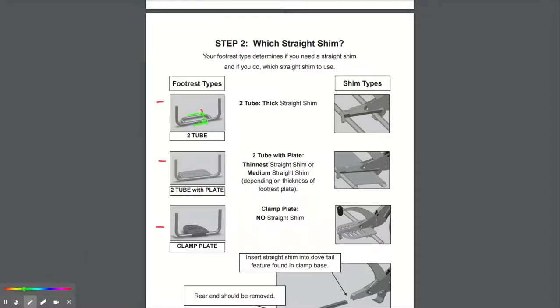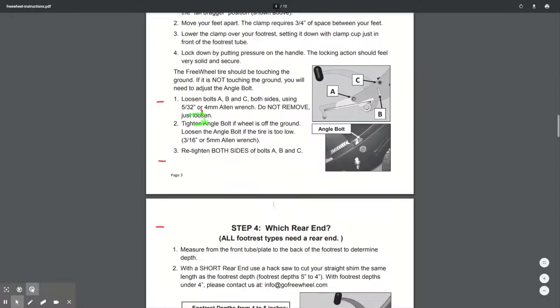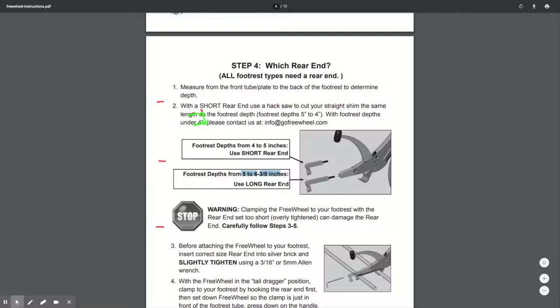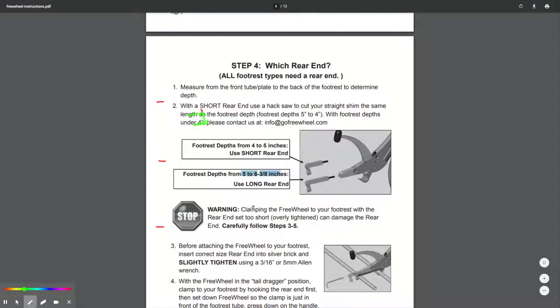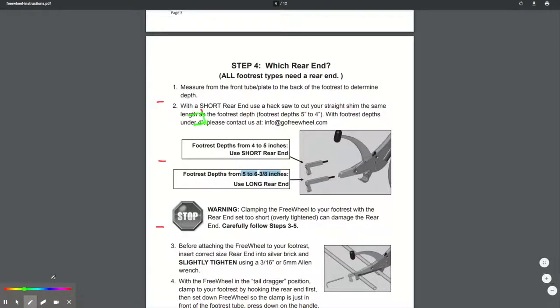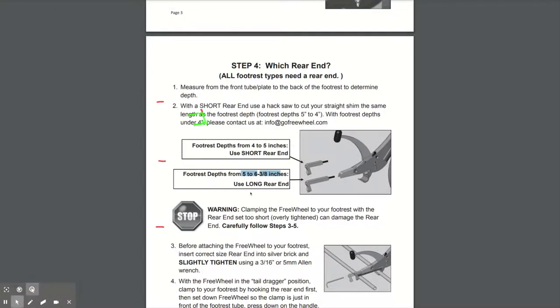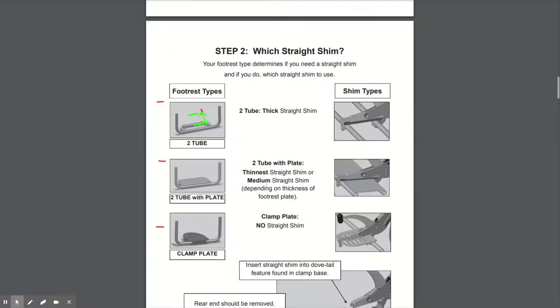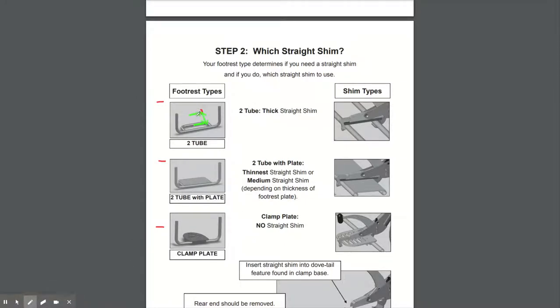That then determines whether you need the short or the long rear end. Now it's in inches, so if it's four to five inches, you need to use the short. If it's five to six and three eighths, then you need the long. Then what you need to do is determine whether you need the thin, medium or thick shim as per here, and cut that shim to the measurement that you've just taken, which is the depth of your footrest.